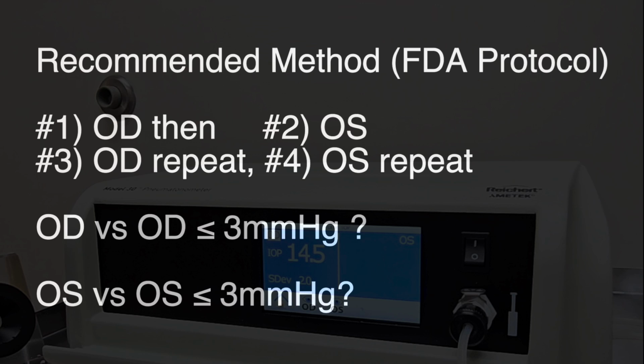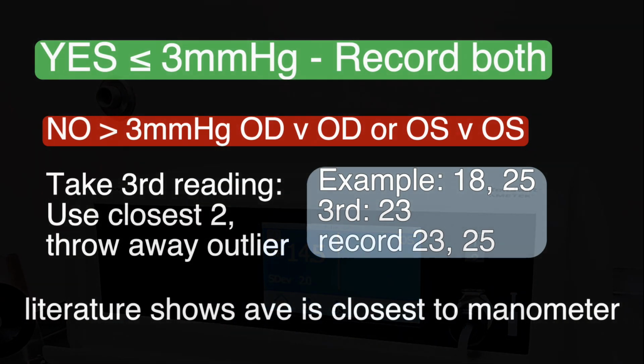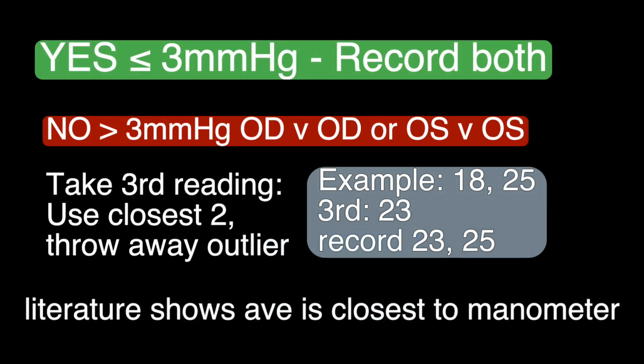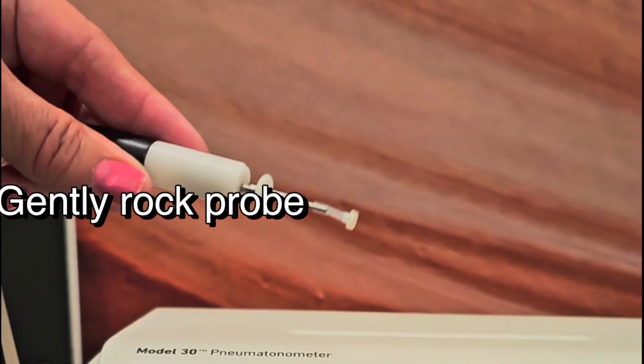The recommended FDA protocol for the studies is right, left, with 2 readings each. The right versus right, left versus left must be 3 millimeters or less. If not, then we do a tiebreaker. So if you do 18, 25 and then you get a tiebreaker 23, you record 23, 25 and throw out the 18. It's really important to do it that way, as that's how all of the studies were done.